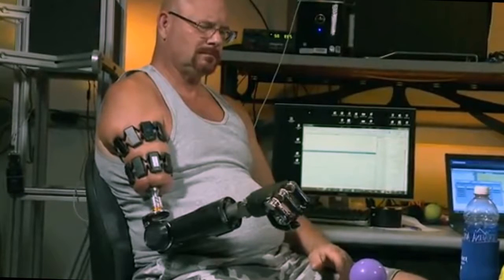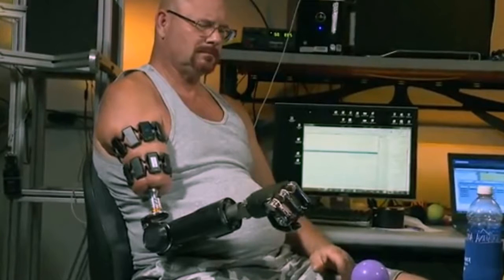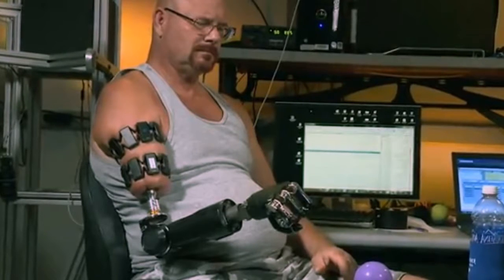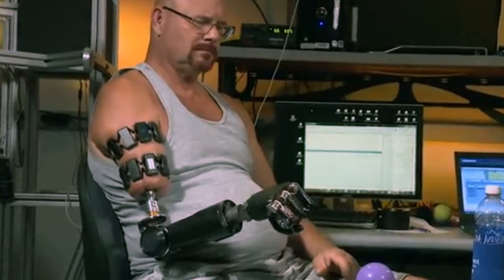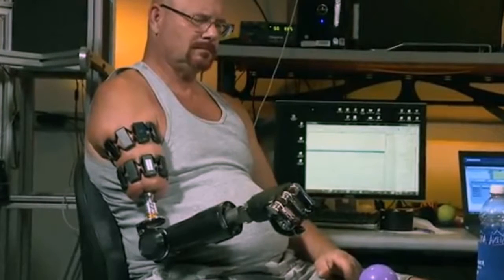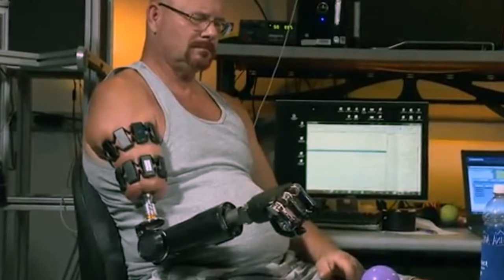A mind-controlled prosthetic arm could revolutionize movement for amputees. The robotic arm attaches to an implant inserted directly into the bone at the end of the remaining part of the limb, and nerve reassignment surgery then allows brain signals to directly direct motion. Researchers at Johns Hopkins University have been working with a test patient to perfect this technology, and today revealed he can move individual fingers and grasp small objects.